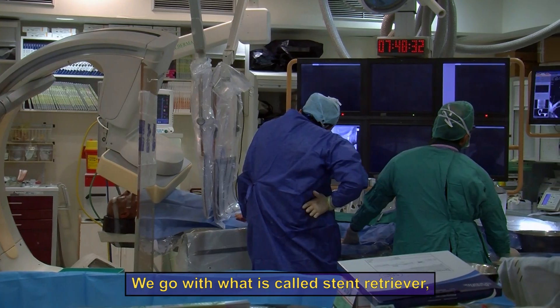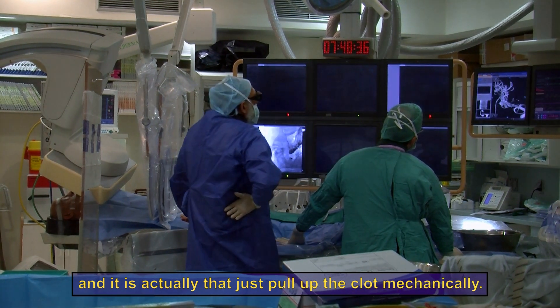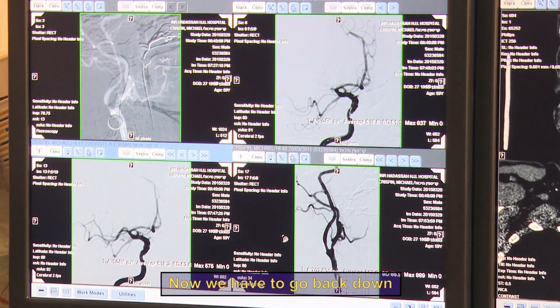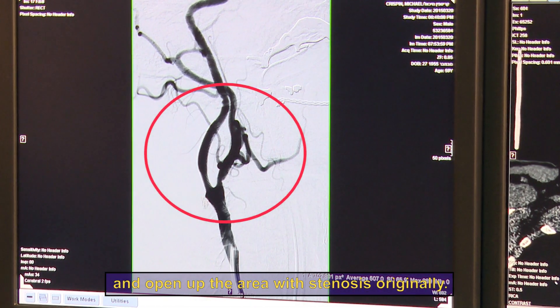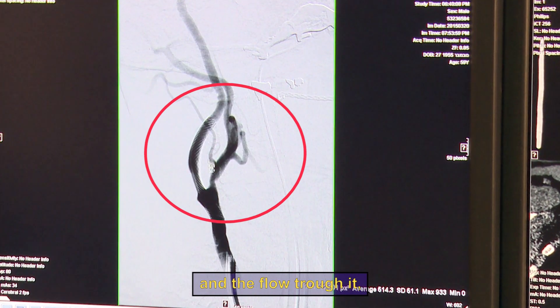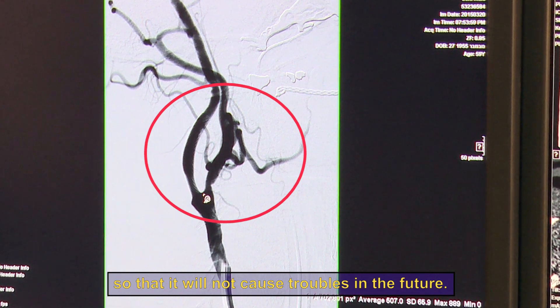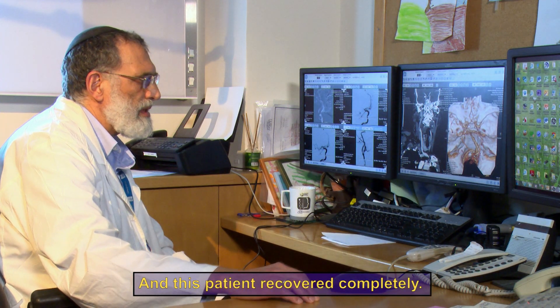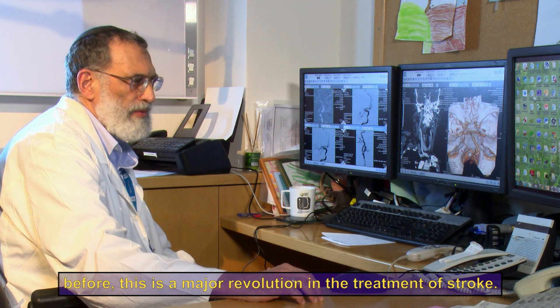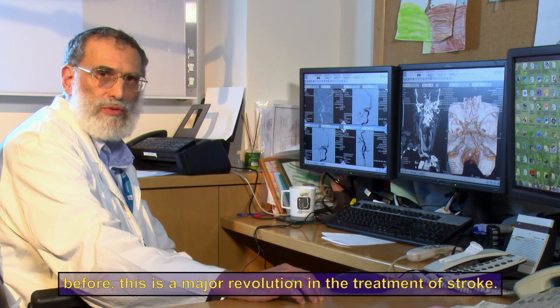We have to open the occluded artery using what's called a stentriever, which mechanically pulls out the clot. After just one pass, we can see it is completely opened. We then go back to open the area that was stenosed originally, placing a stent and restoring flow so it will not cause trouble in the future. This patient recovered completely — something that was usually a death sentence before. This is a major revolution in the treatment of stroke.